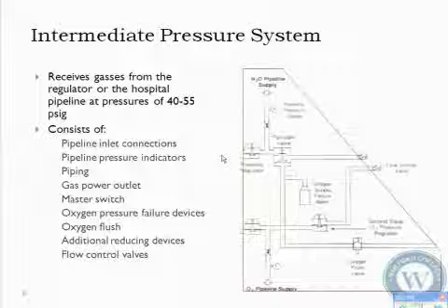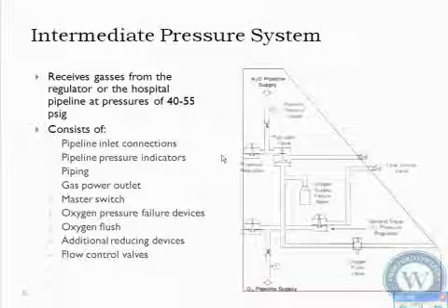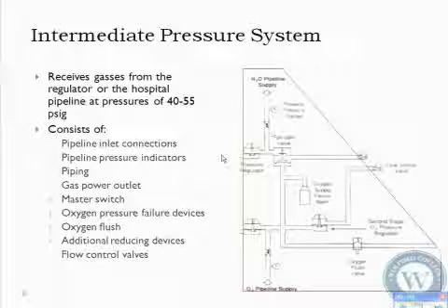So you never want to flush your O2 whenever you are on the ventilator on the inspiratory cycle, or else you can give a huge amount of volume in just seconds. Those flush valves range between machines, but they're going to feed around 35 to 75 liters per minute of O2. Hold that flush valve down and it's going to give on average around 50 liters per minute. It's not going to kill a patient immediately, of course, because at any one time we're ventilating with quite a volume, 600 to 1,000 mils. If you hold it down for a second, you could get about 750 mils or so. But that's also going to your bag, filling up the bag, so there's some safety in that.